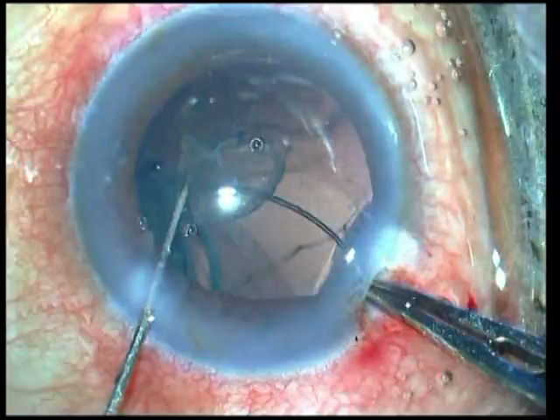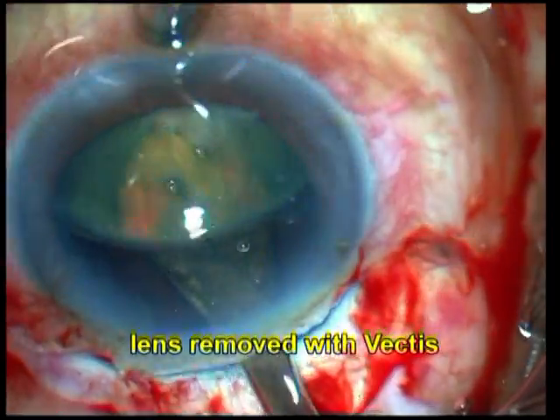Since the capsular tension ring was beginning to look more and more like a ring of horror, it was finally abandoned and the lens was removed using a vectis.